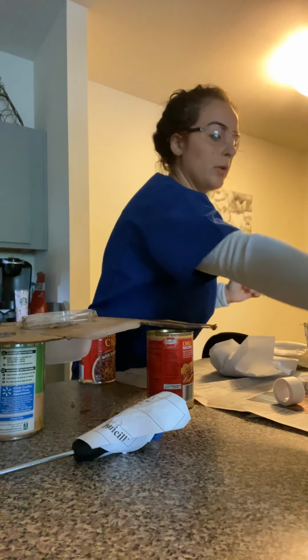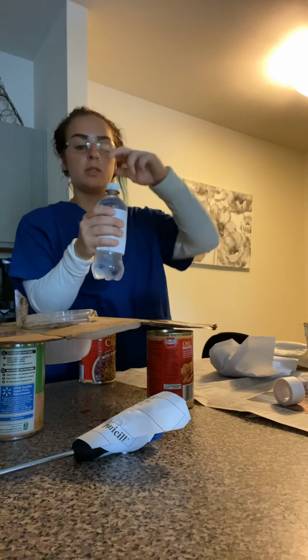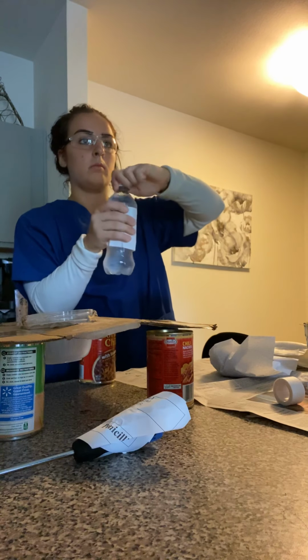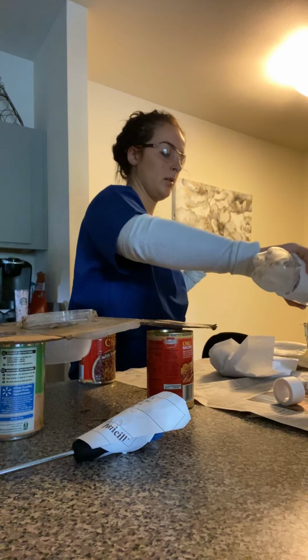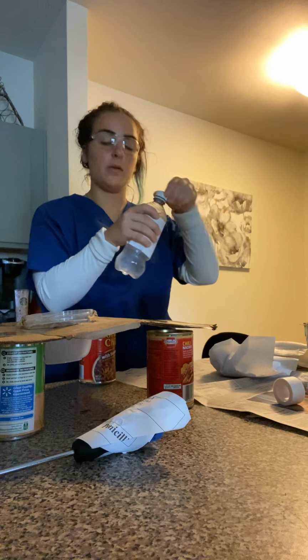At this point, I'm going to check my saline for the expiration date and palming it from the label. I'm going to open it cap up, facing up, and dump some of the solution into the basin. There we go, and closing it back.